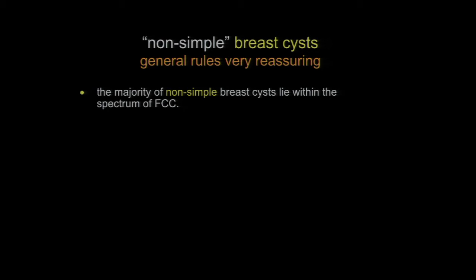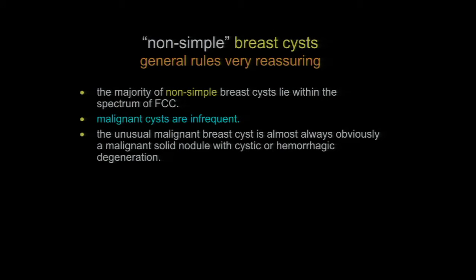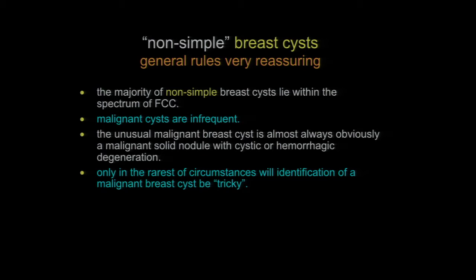So general rules are very reassuring. The majority of non-simple cysts simply are part of the fibrocystic spectrum. Malignant cysts are relatively infrequent. The unusual malignant cyst usually doesn't even look cystic. It looks like a solid nodule with liquefactive or hemorrhagic necrosis. Only in the rarest of circumstances do we find cysts tricky.